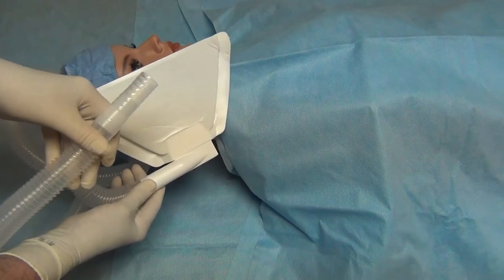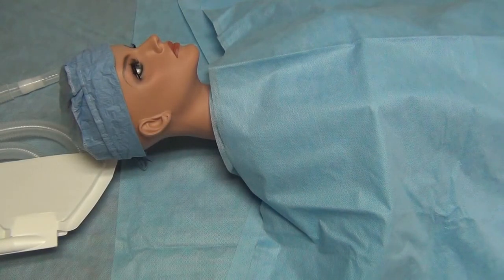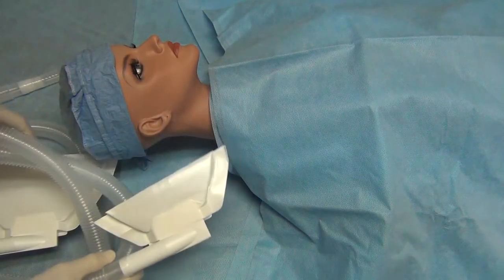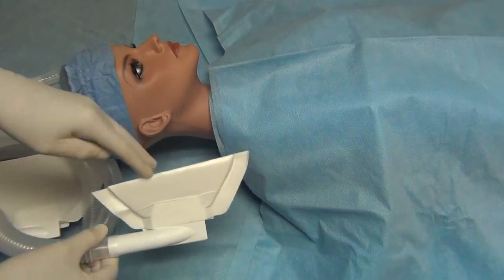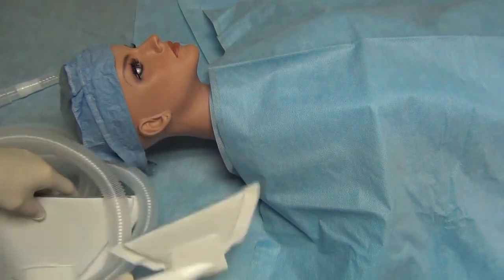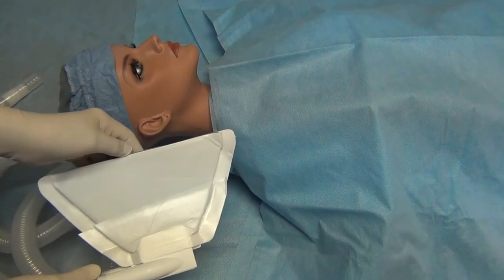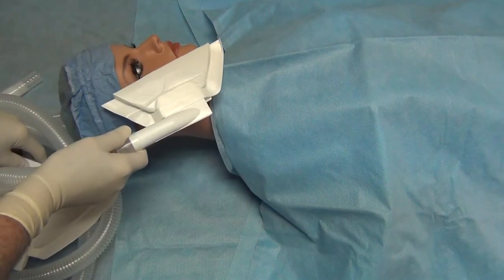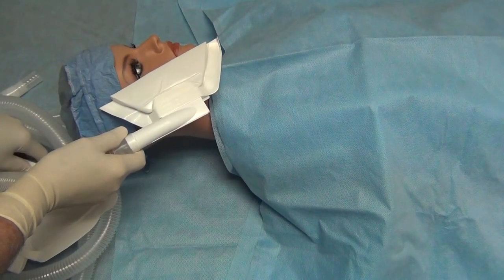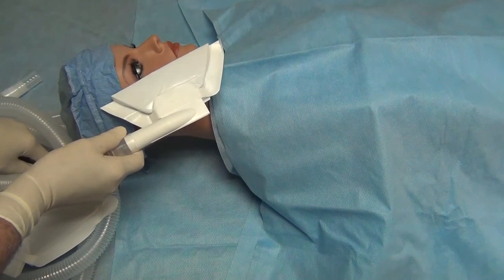Now let's say that you think this is too big. By the magic of movies and a straight scissor, we have just taken off a good portion of the mini square, the original shape, made it much smaller and therefore can fit the face of a smaller patient a lot easier. But the process is the same.